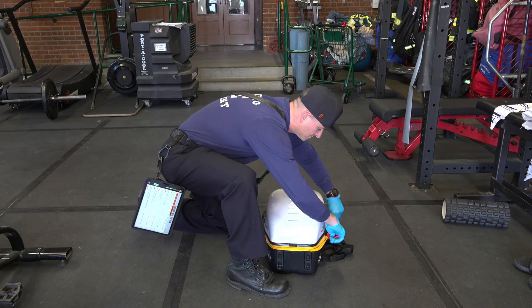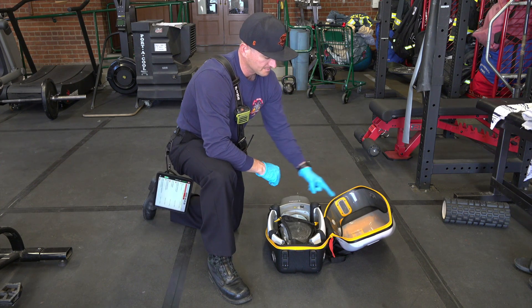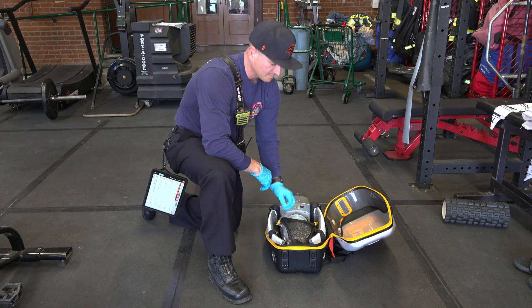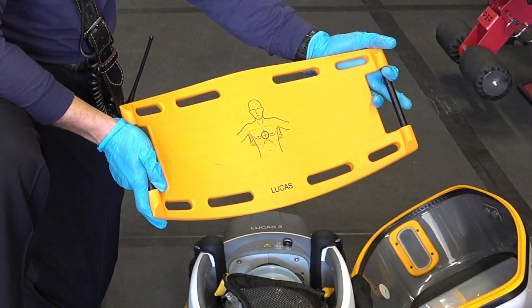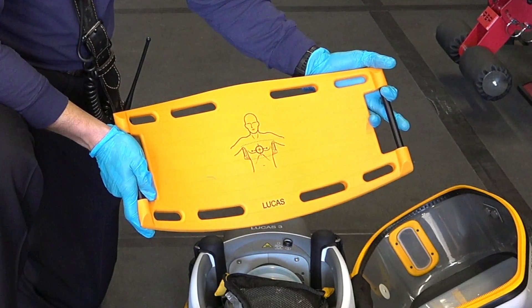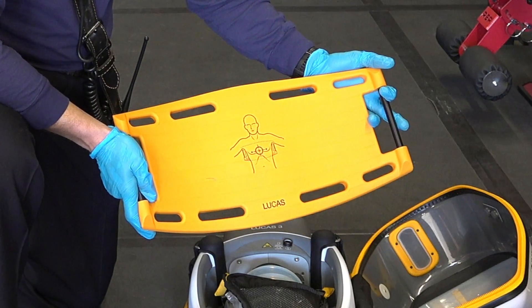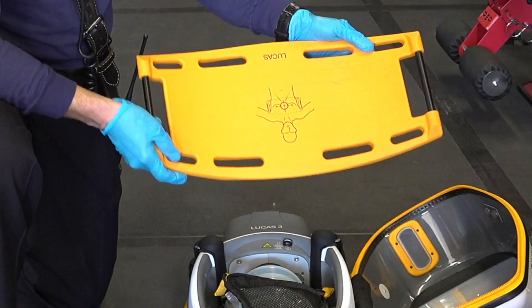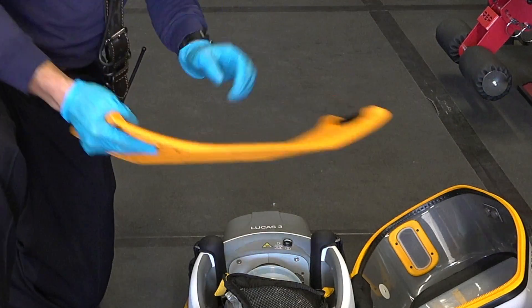As he unpacks the Lucas device, you'll notice that immediately the backboard's on one side, the Lucas device is on the other, and then this pouch on top is where you find the shoulder strap. Let's start with the backboard. The backboard has a diagram on it — the X is right between the nipples. That's where we want to optimally place the suction cup, and the backboard needs to be positioned perfectly right there. It doesn't matter which orientation the backboard's in; it can go underneath the patient in either direction.